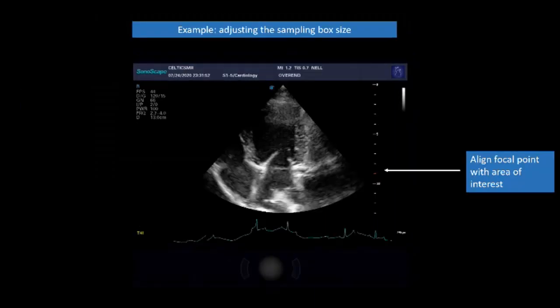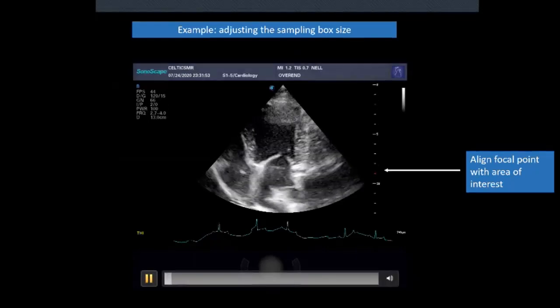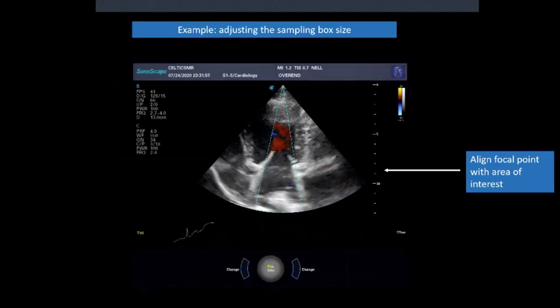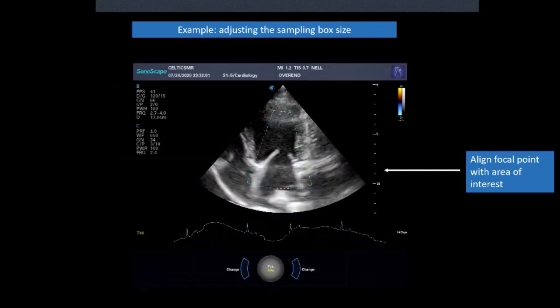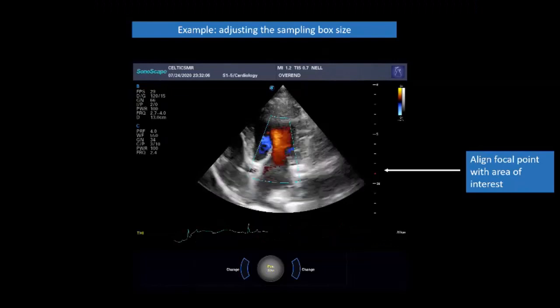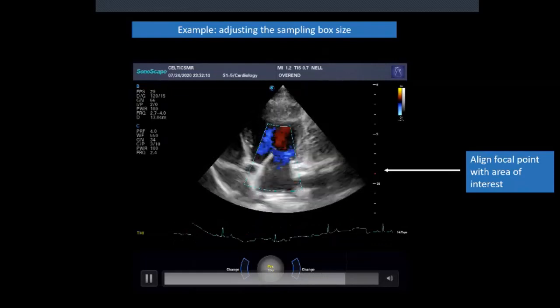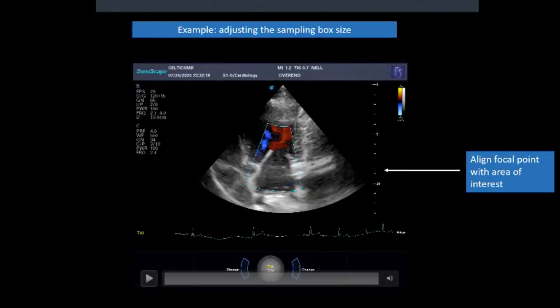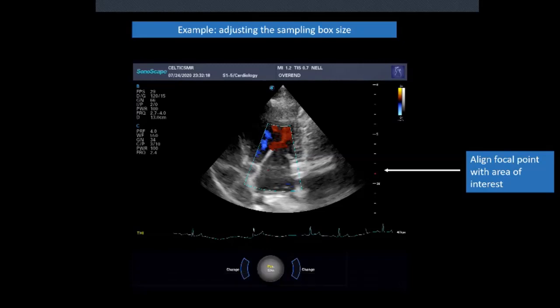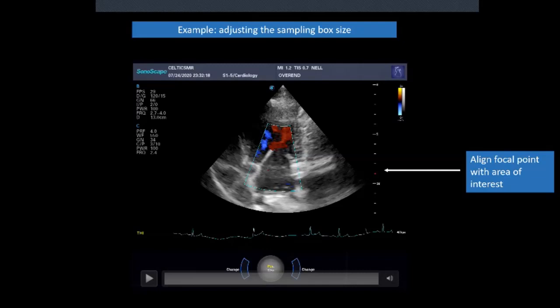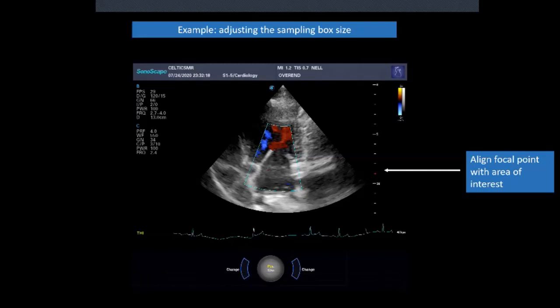Here's an example with my own dog. We get a good B-mode image, press the colour button, the box is too big so I change its size and optimize it for mitral flow. You can see she's got a little leaky mitral valve — that's the blue — and the red you can see on the other side of the valve is normal laminar mitral inflow. Regarding the focal point: it wants to be in line with the area of interest. In modern machines, whenever you press your colour flow box the focal point sits exactly where the colour flow box is. With older machines, you had to also manually consider focal point position.